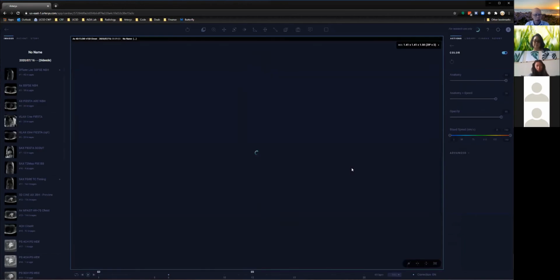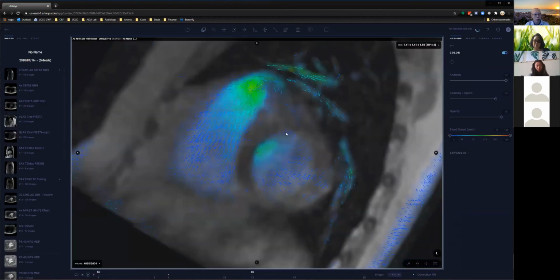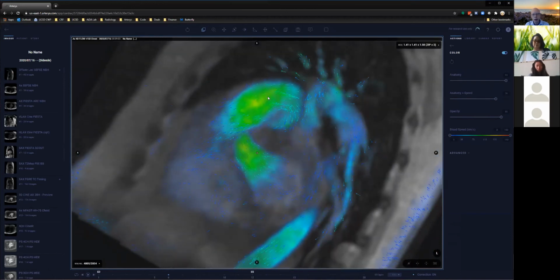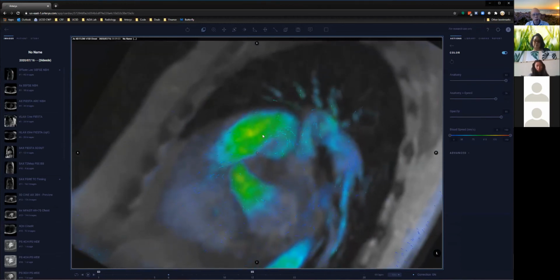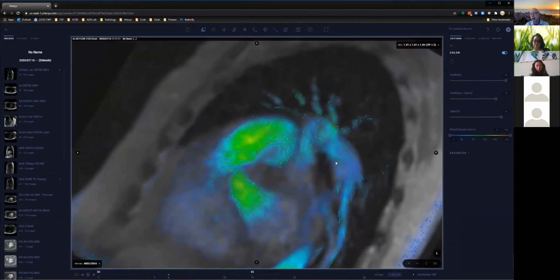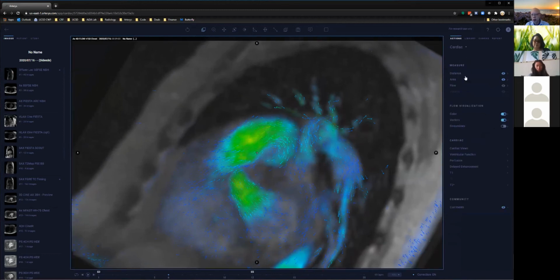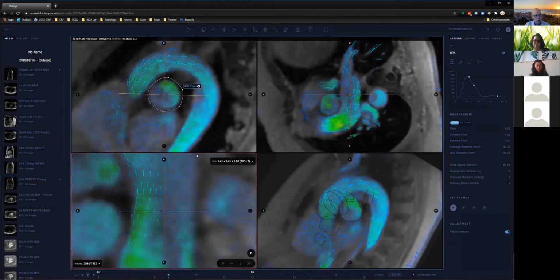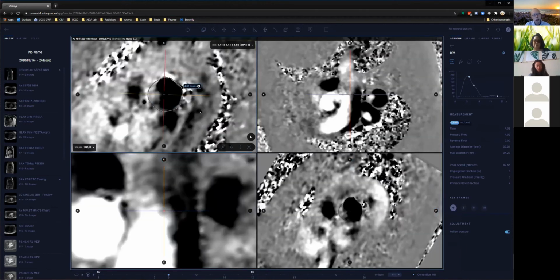Yeah. So a number of years ago, people published on that specifically. I remember seeing some paper from 30 years ago from Norbert Pelc, even, where they drew big contours, because most of the velocities outside of the vessel, as long as you're not drawing a contour into the other vessel, are zero, right? Unless you're in noise, right?